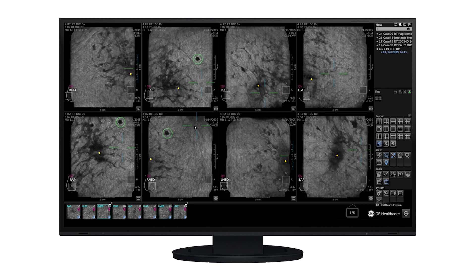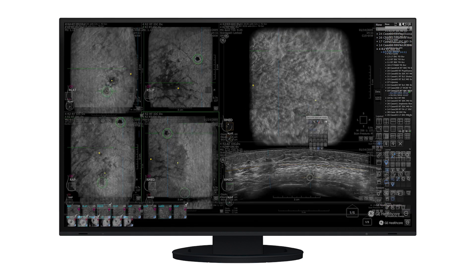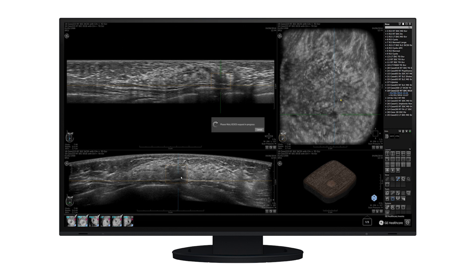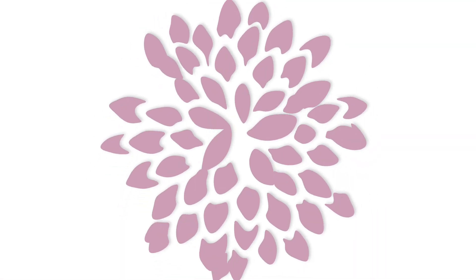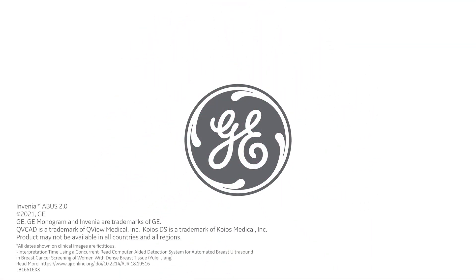QView CAD provides a single image of each acquisition, making reading time much shorter and more focused. The Invenia A-Bus AI Assistant can now seamlessly integrate with powerful third-party AI solutions to help make the overall A-Bus interpretation faster with improved cancer detection.